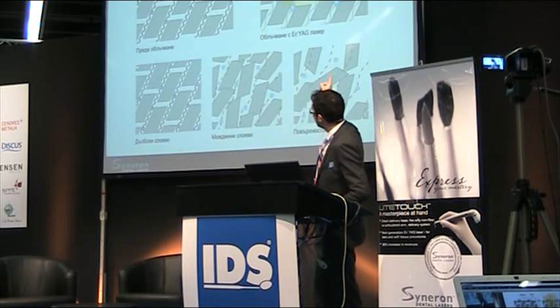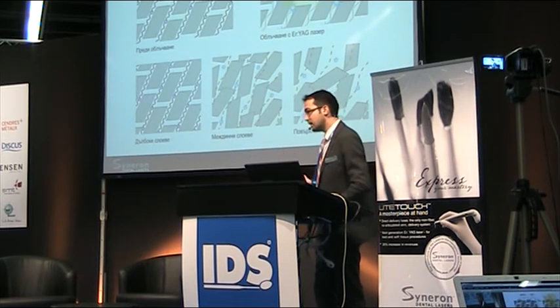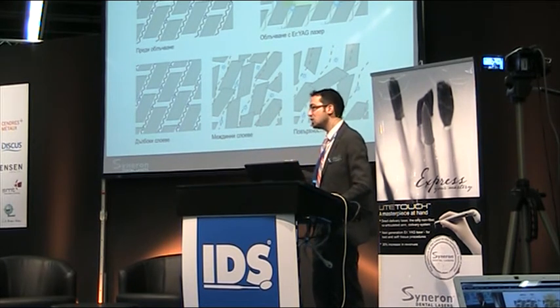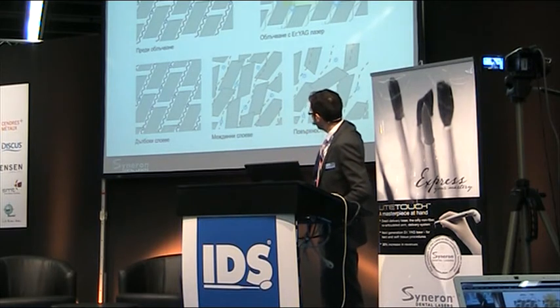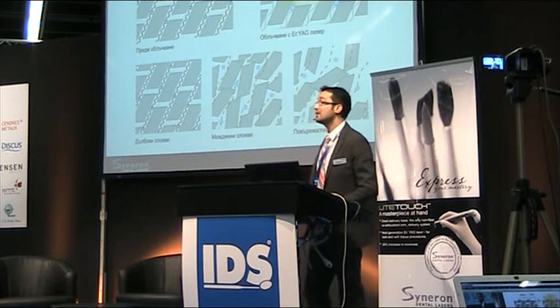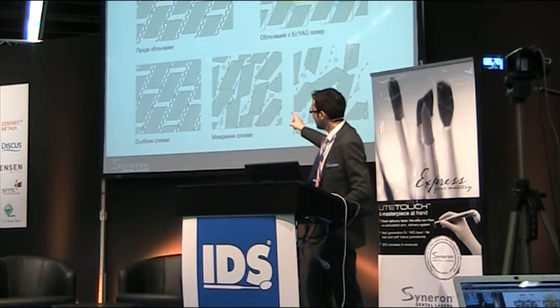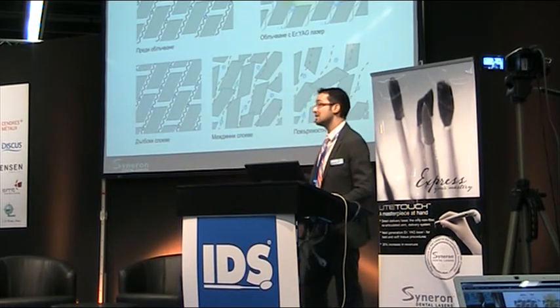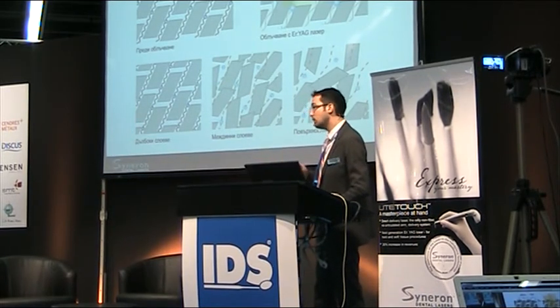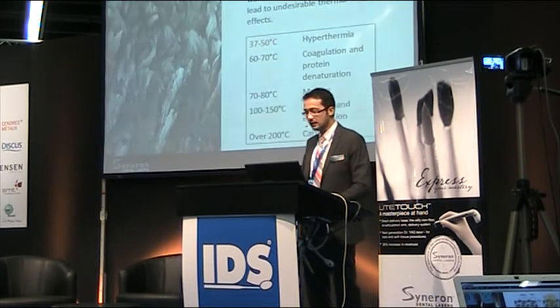When we treat the area with laser, the water molecules explode. They contact this laser energy and then explode. In the superficial layer, we have the ablation. This explosion leads to ablation, to destruction, and we remove tissue. In the middle area there are small changes in the crystals, but we do not remove, and the deep layer remains intact.